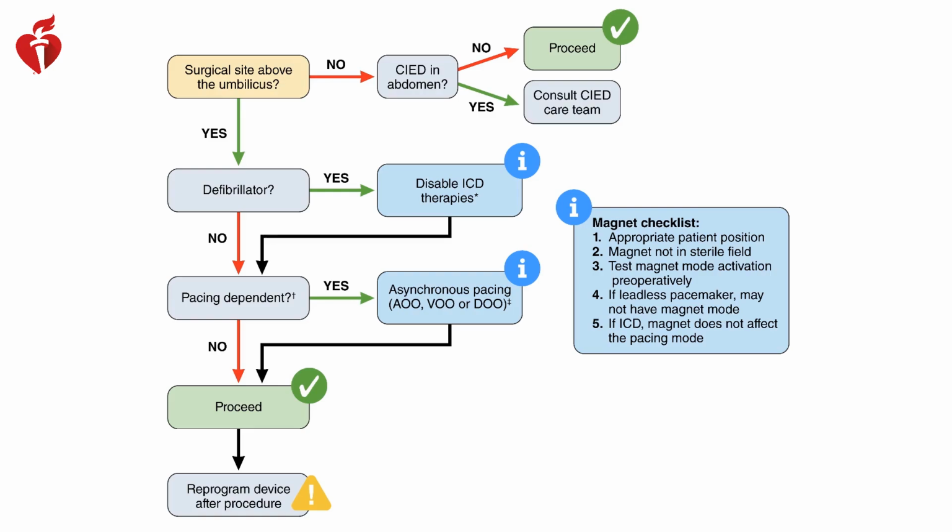Next, if the patient is pacing dependent, the device should be put into an asynchronous pacing mode so that electromagnetic interference will not cause inhibition of pacing. The surgery is the next step. And finally, reprogramming the device after the procedure is always performed before the patient leaves, and tachytherapies are re-enabled.